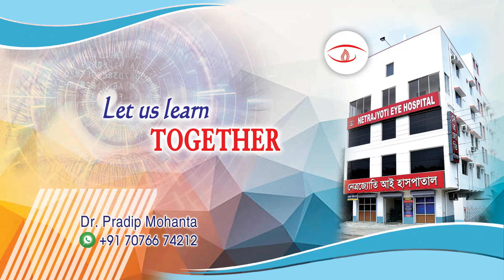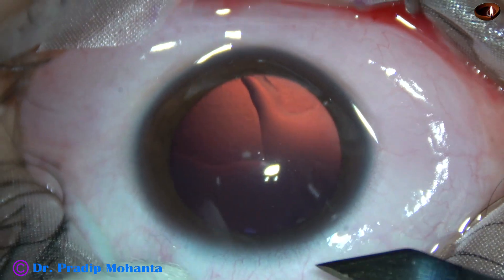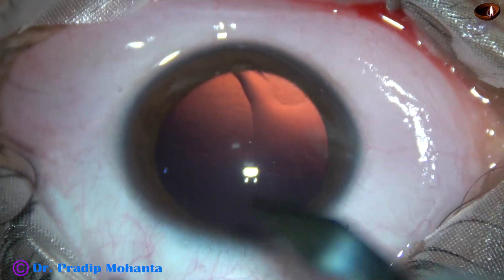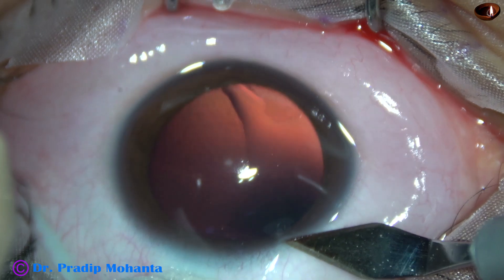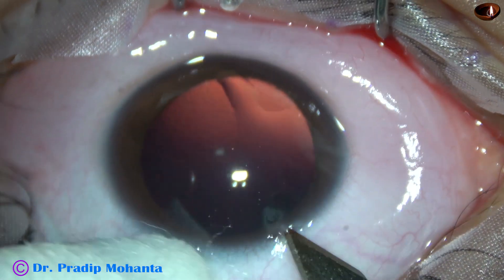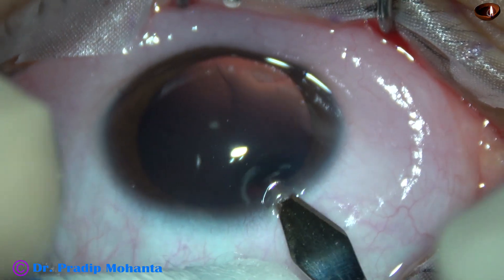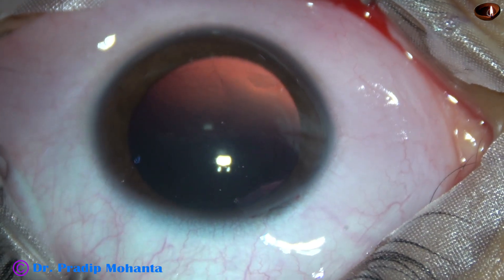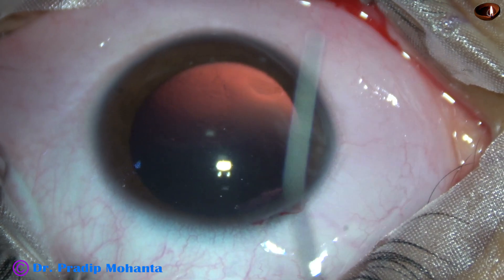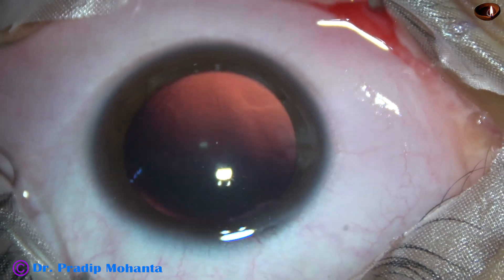In this video we are going to watch clear lens extraction with intraocular lens implantation. The patient is a young lady of 20. She has been explained about all the pros and cons of clear lens extraction with intraocular lens implantation. The option of phakic IOL was given; contact lens she doesn't want to continue anymore. LASIK is contraindicated in this case.